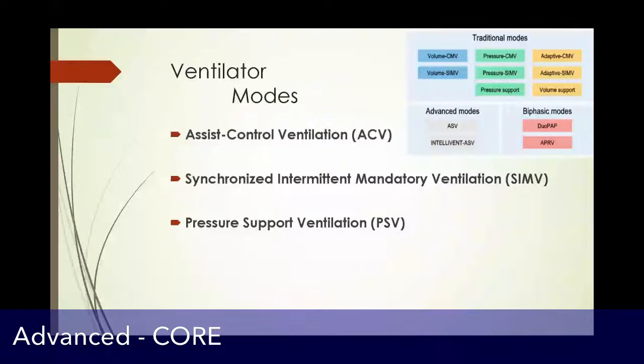So next is going to be your ventilator modes. These are broad categories, and there are several of them. I'll talk about the most commonly used. Really, with all the different modes and settings, you have about 178 different ways of ventilating someone. None has been proven to be more effective than another. It's really going to be case dependent, and you're going to have to think through the disease process and their physiology and what you're trying to accomplish.